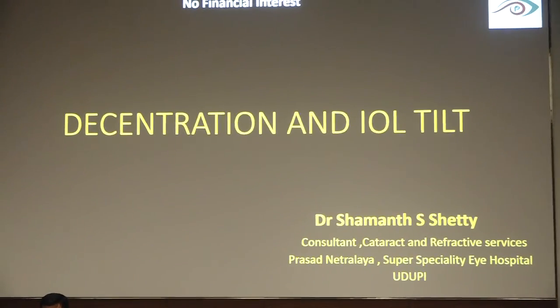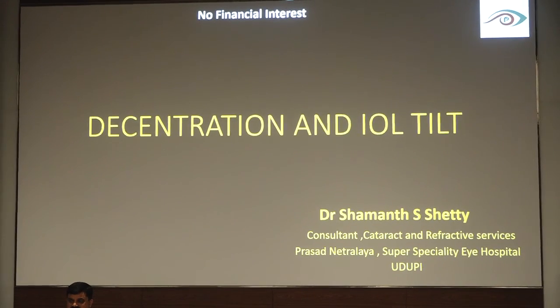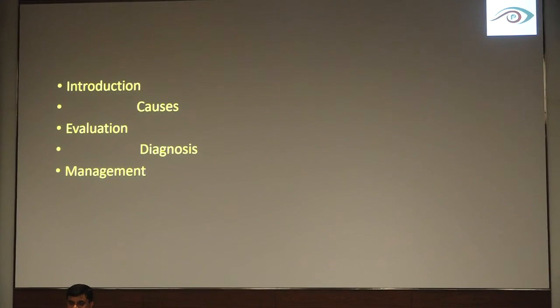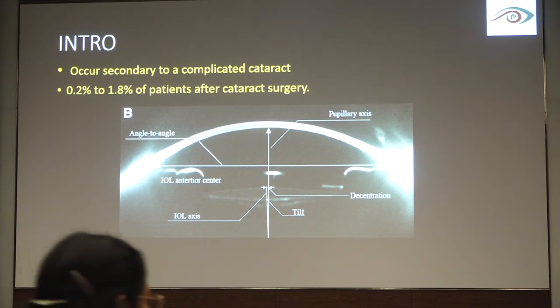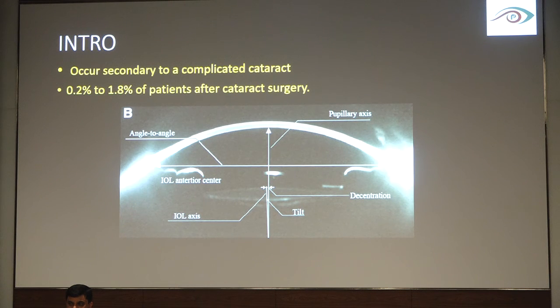I'll start with my topic, and that's decentration and tilt in IOLs. Let me give you a brief introduction. We see this not only after complicated surgery, but even after a normal cataract surgery. Usually, we can see this in 0.2 to 1.8% of surgery patients.